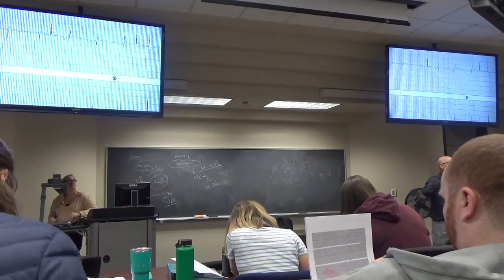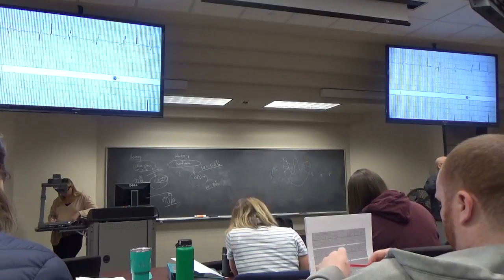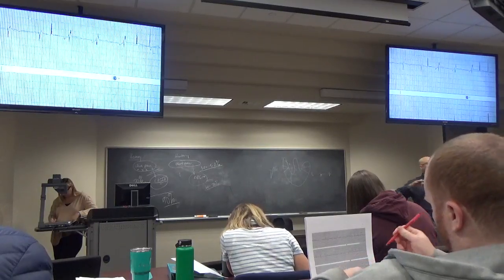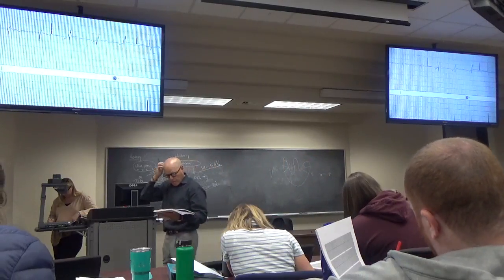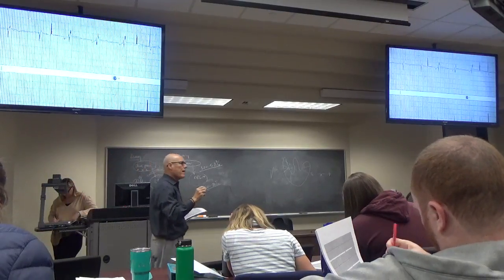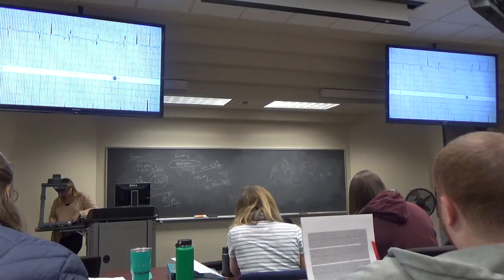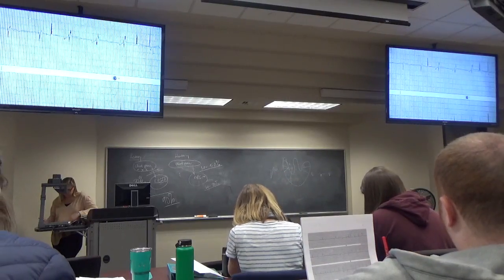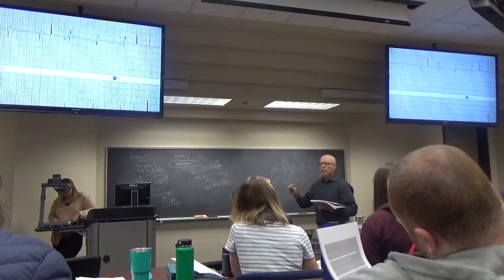There's something weird going on in the atrial pacemaker. And what cardiologists would call this is aberrant atrial conduction. It didn't come from the SA node, because this P wave is too weird looking in V1. At least in that beat, it came from somewhere else. And since the atrial conduction was aberrant, maybe the ventricular conduction is aberrant as well, which would explain the RSR prime. The point here is, do the intervals first.